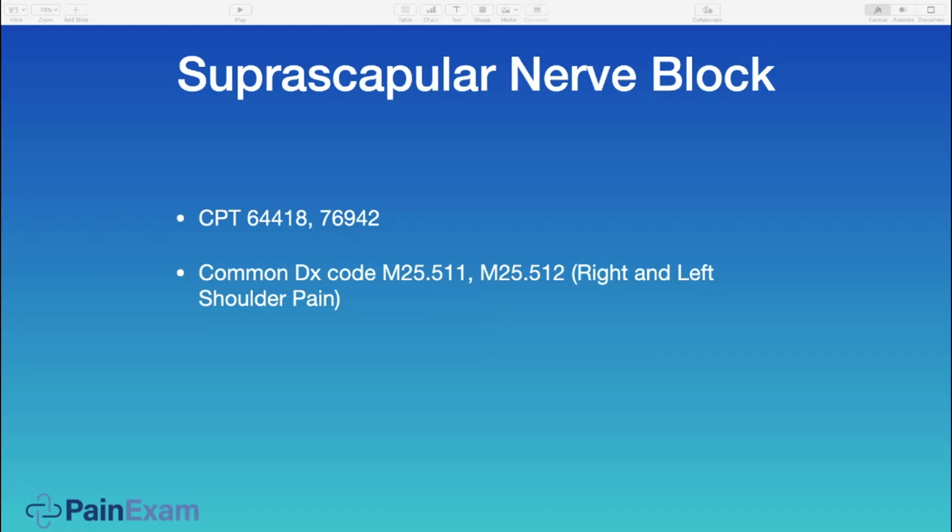And on the patients who have a cervical radiculopathy and they say, oh, yeah, I have pain right here, and they're pointing to supraspinatus, many of them will get relief with this, and they will not need the cervical epidural. Additionally, if you're an anesthesiologist, feel free to use this block in the hospital for postoperative, perioperative pain control.